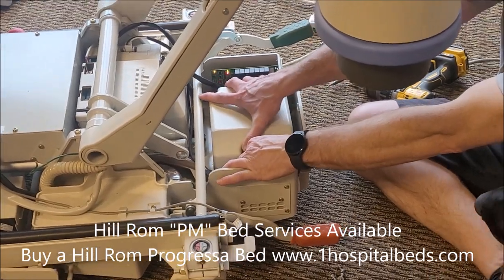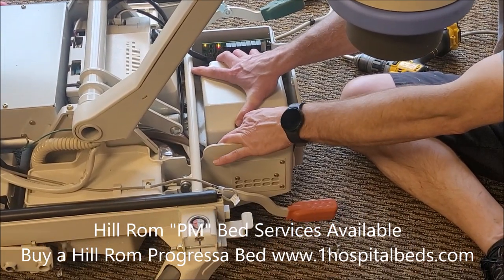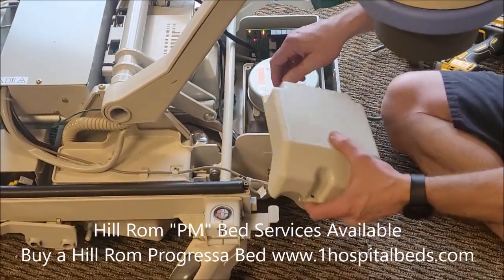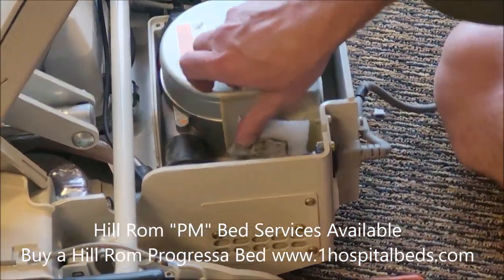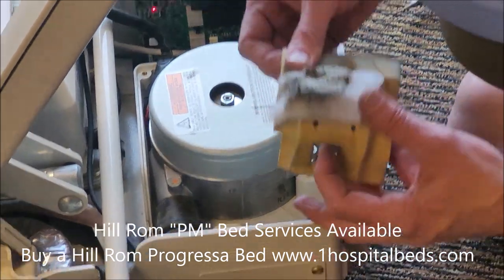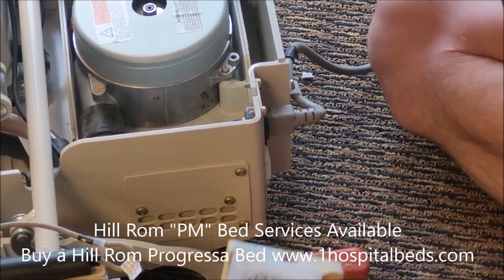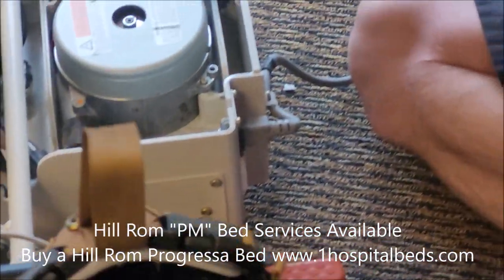All right, so we're just doing another real quick video with Jeremy, our Hill Rom bed technician. We're going through the Hill Rom Progressa bed. And Jeremy, we were just talking on the earlier video about the lack of people actually going in and cleaning out the filters.